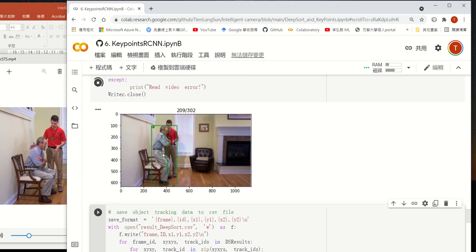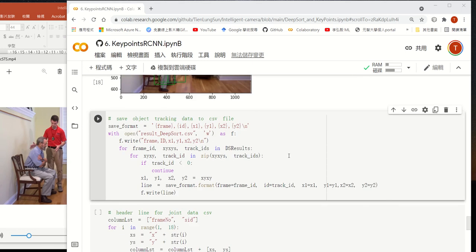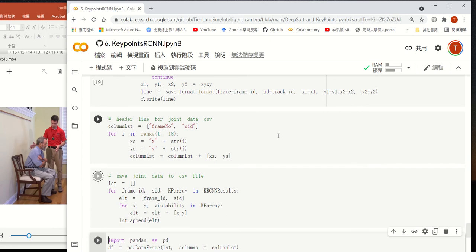So I'm going to pause for a while to let it finish. It takes about 3 to 4 minutes for DeepSort and PyTorch KeypointsRCNN to extract data. Now we want to save the data to a CSV file, so just keep running.